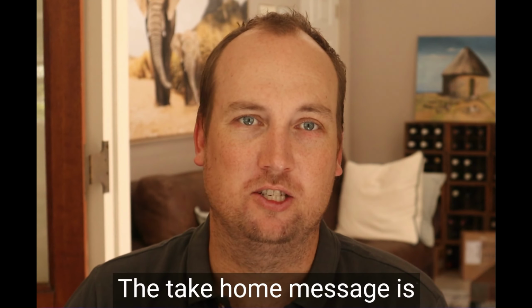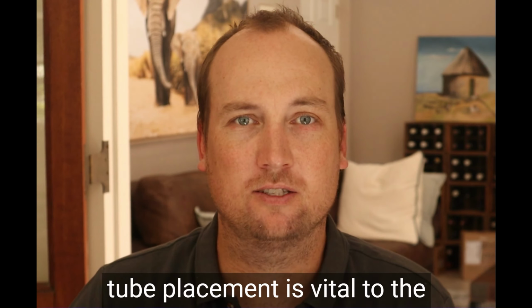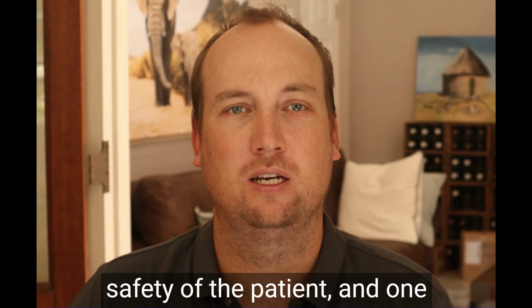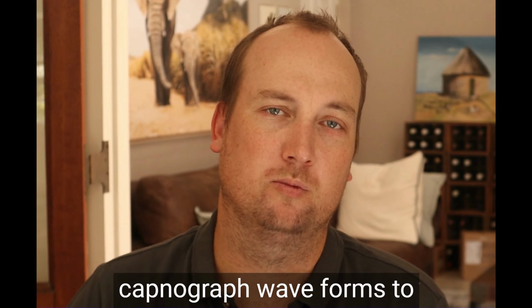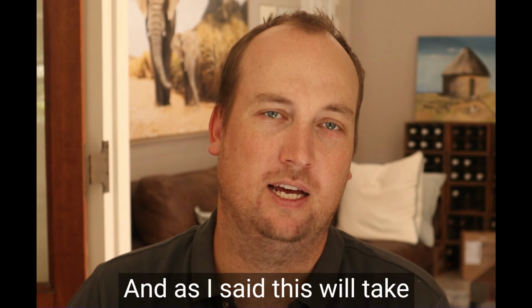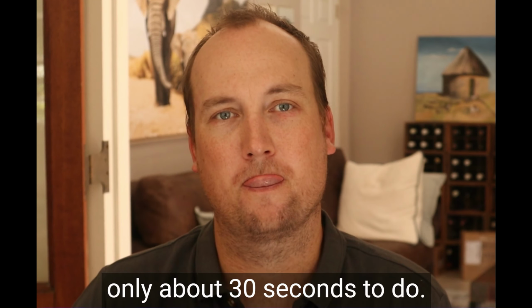The take-home message is that confirming endotracheal tube placement is vital to the safety of the patient, and one needs to watch at least 7 capnograph waveforms to be certain of placement. And as I said, this will take only about 30 seconds to do.